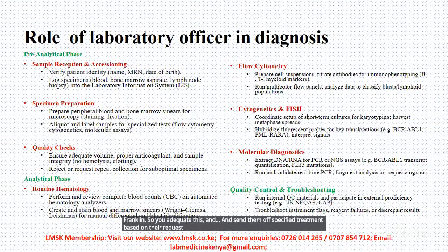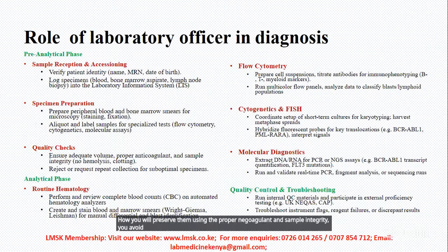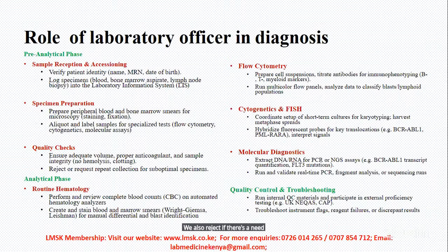You can do flow cytometry, cytogenetics, molecular analysis. You also ensure quality checks in terms of volume, how you preserve them using the proper anticoagulant, and sample integrity. You avoid hemolysis and clotting. You also reject if there is need, if the specimens are not meeting the criteria.